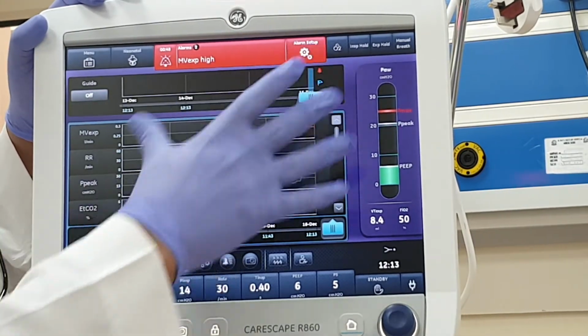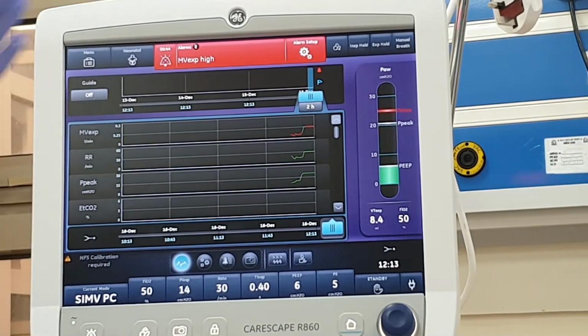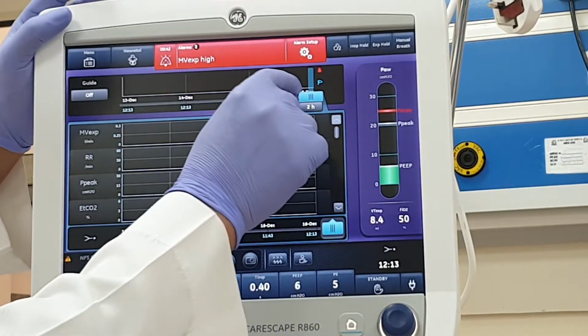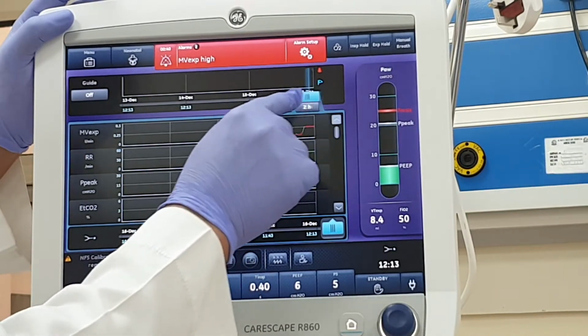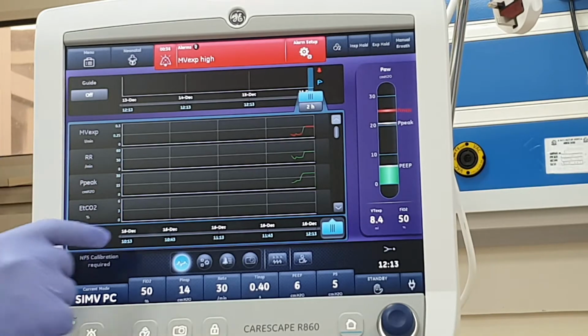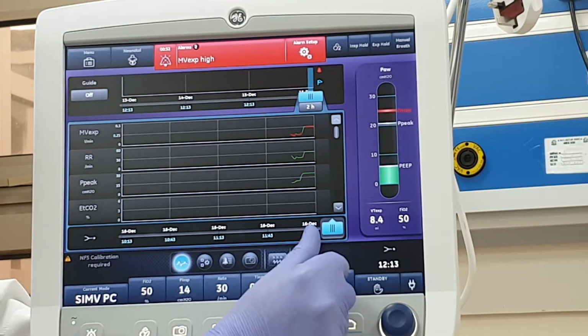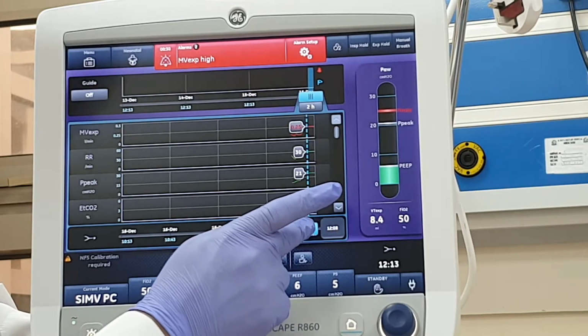This interval is expandable over this thing. So it's like a zoom in, 2 hours in the 16th of December at 12:13. So it will give you from 10:13 to 12:13, and you could easily navigate through that.